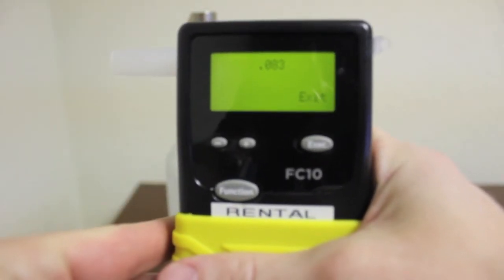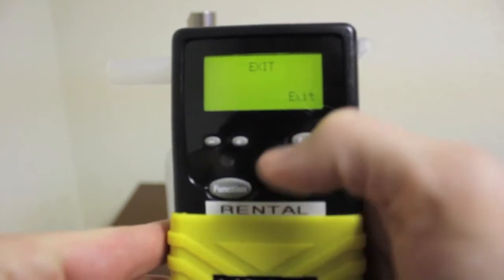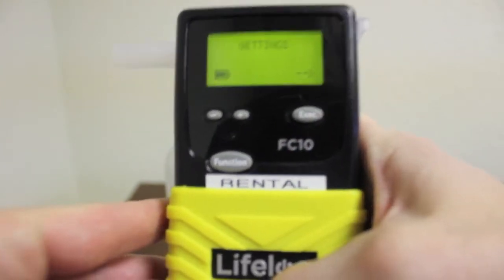In this case, our result is 0.083, which is within plus or minus 0.005 of our gas standard.